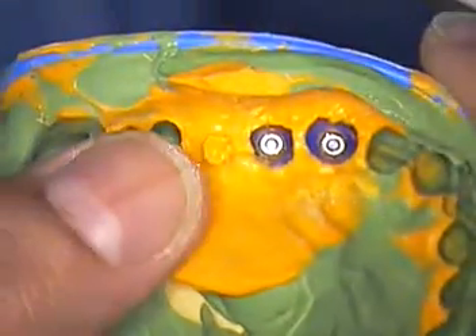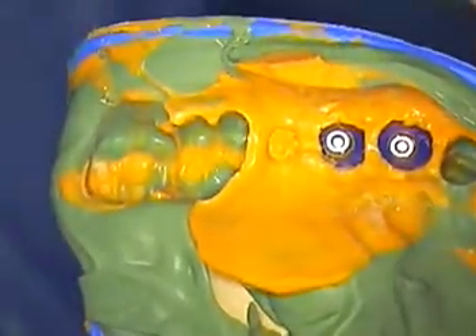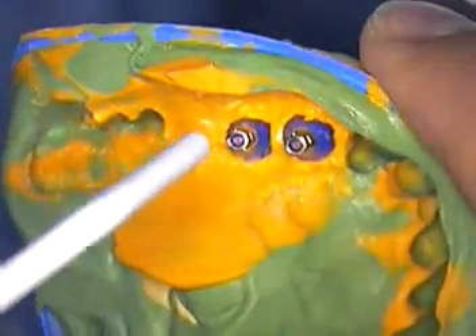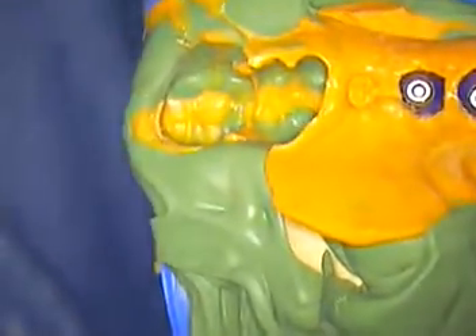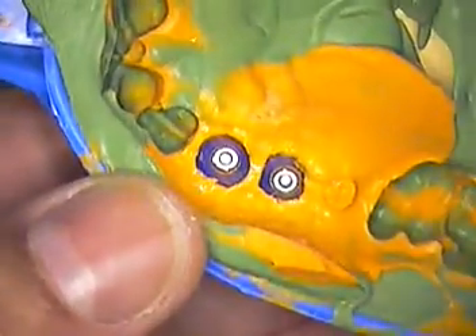Hello everyone, this is Dr. Jerry Cuomo again with the bone level implant case. This one happens to be a Strumann with our modified impression coping. We modify these impression transfer copings right here in the office and have them ready prior to going into the operatory for the impression.